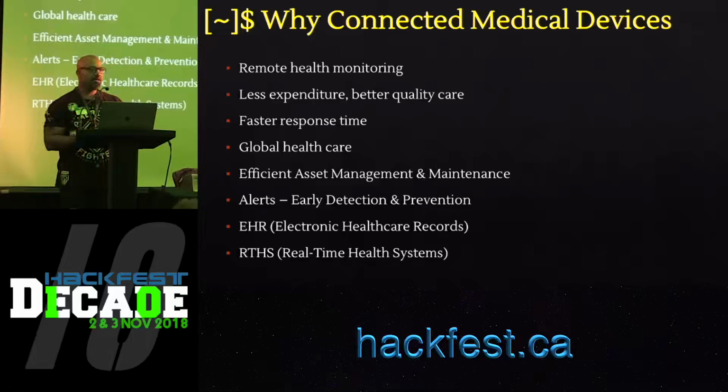Interoperability is going to be another issue because tons of devices, especially from different manufacturers, talk on different protocols. So to get them to talk to each other is also going to be a challenge. Authentication and authorization could be a big challenge because I think we are approaching a time where, and I think it's still happening in some of the medical institutions, patients can bring their own device in, which is connecting to the medical institution's network and then transferring data. So how do you differentiate between a legitimate device and a malicious device?